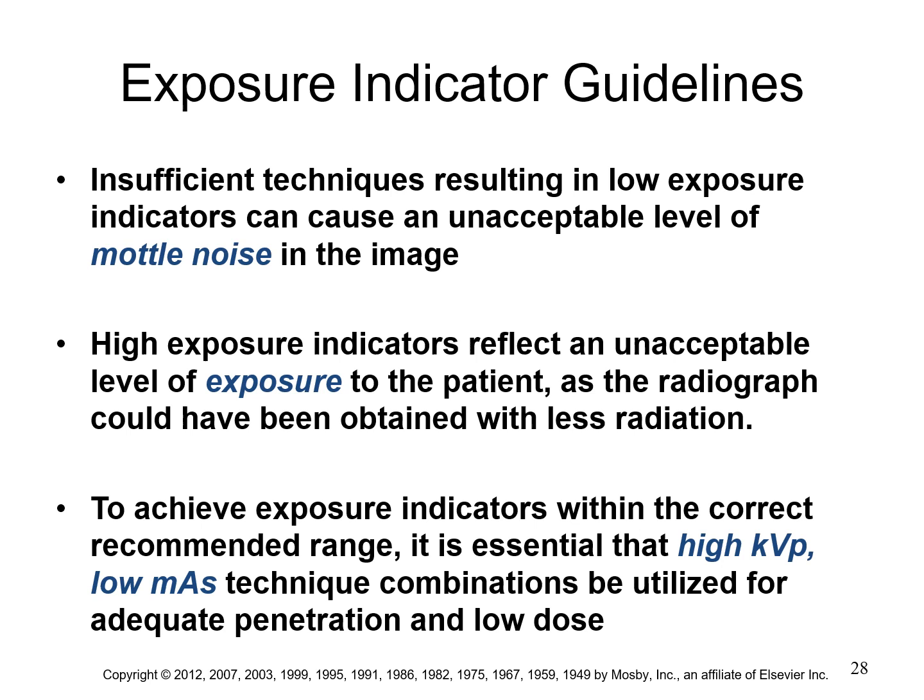Okay, to achieve exposure indicators in the recommended range, use high kV, low mAs techniques as a general practice. Now, what is the specific kV and what's the specific mAs? Well, that's going to change from body part to body part and projection to projection. Okay, but in general, high kV, low mAs.